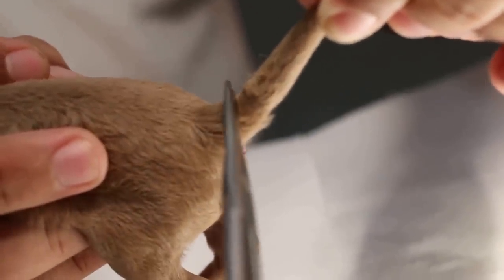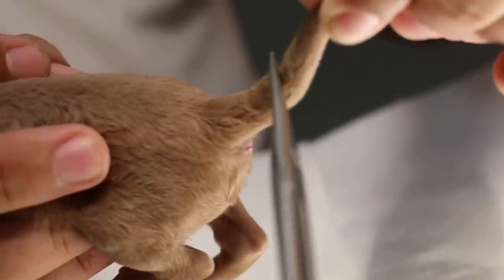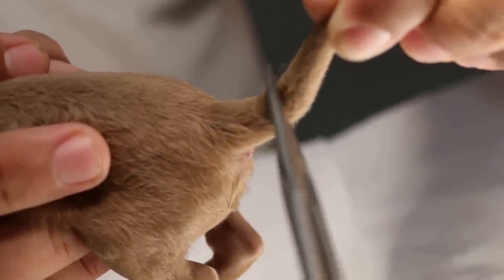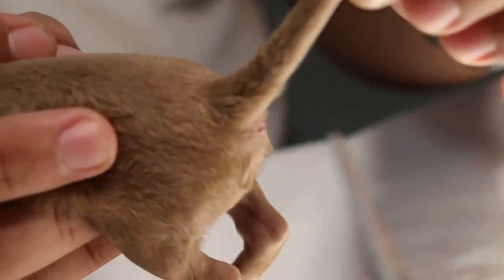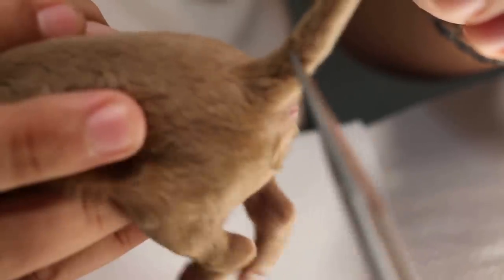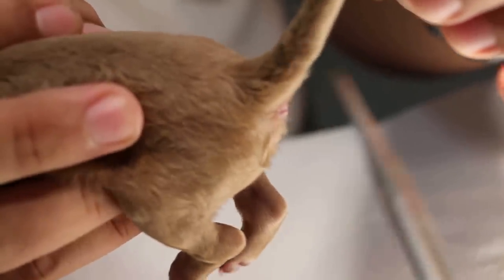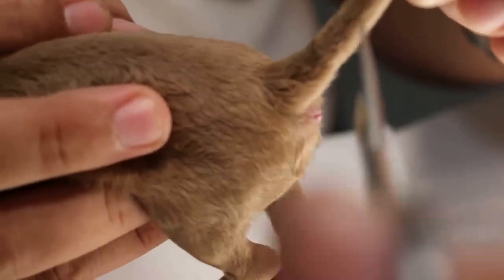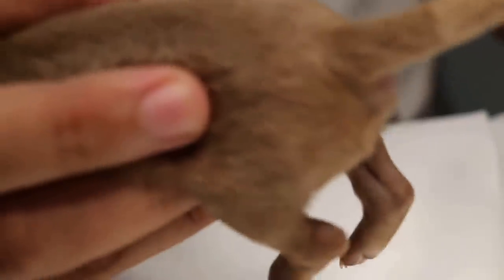You do this at 45 degrees, push the skin forward, and then cut. When you cut, the skin on top will go backwards and you have the extra skin to cover the bone. Potassium permanganate is used because the puppy is two days old, so you don't need to stitch up — the potassium permanganate will stop the bleeding.